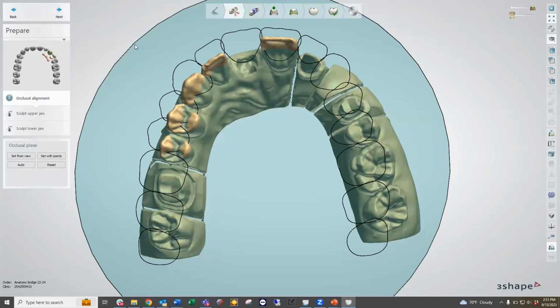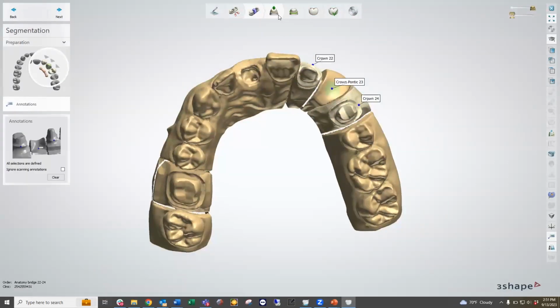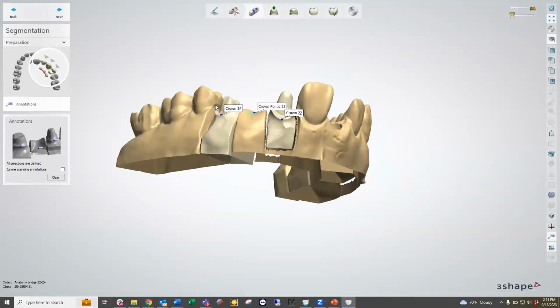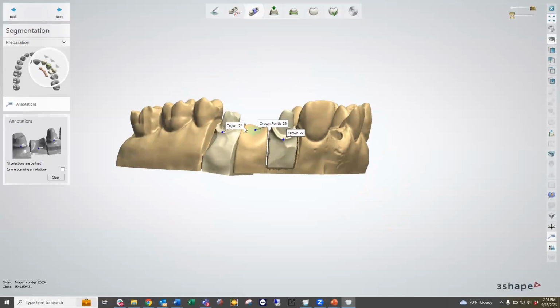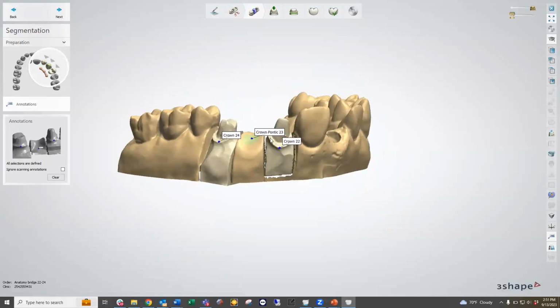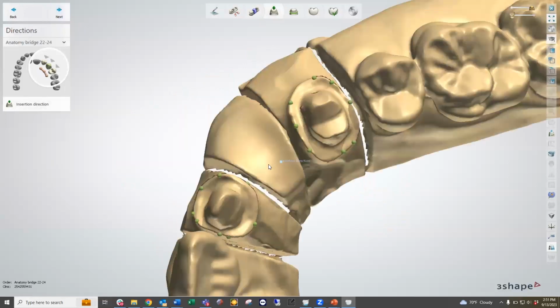So I'm just going to go ahead and kind of force through the first few steps, because we've already gone over those within the single crown stage, where we talk about the segmentation and we just confirm our annotations. Again, I apologize for having FDI on. I know that this isn't what we're typically used to, but we do know that this is 2.2, this is 2.3, and this is going to be 2.4. And we'll go ahead and take a look at the margin lines and the directions of the insertion path now.